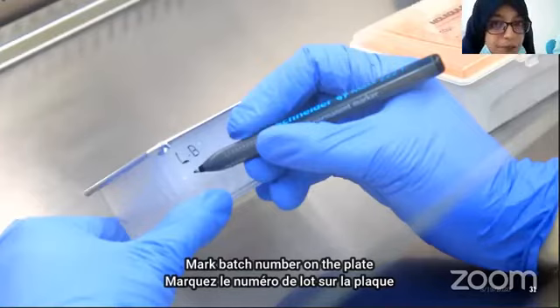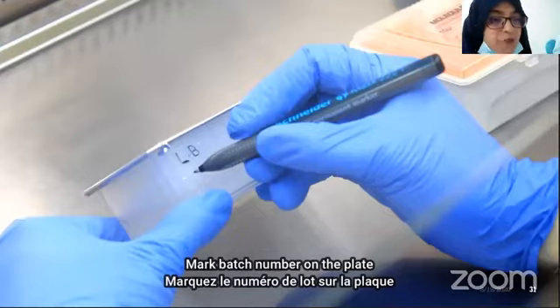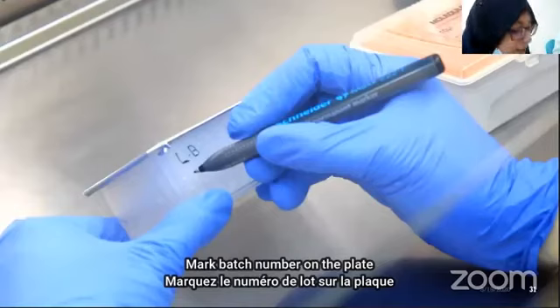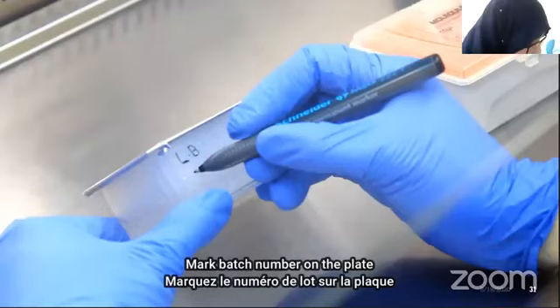So after making the batch, we have the particular batch number and the number of samples with the identification code. So we make a proper sheet or template, and we follow that template during the addition of the samples. This template is not shown in the video, but we make this type of template. And it is very easy to make the template if you have a batch with different types of samples.